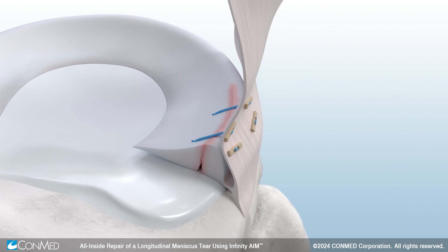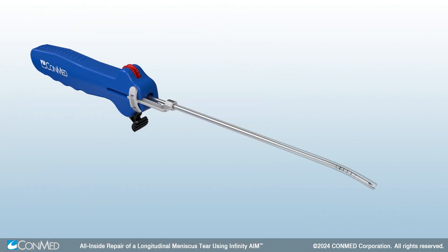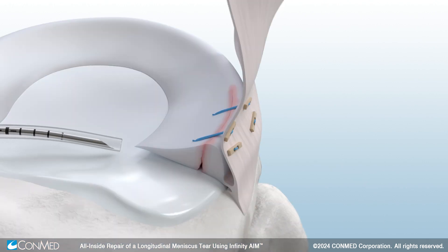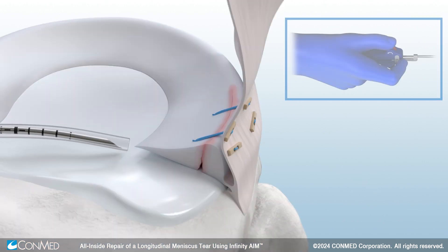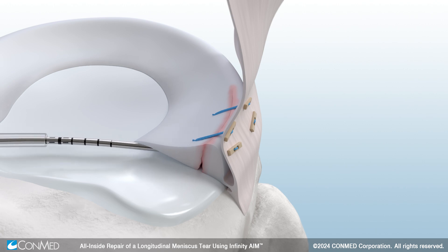The inferior part of the meniscus tear is now exposed. The Infinity Aim 15-degree reverse curve will now be used as it facilitates access to the inferior part of the meniscus. Position the device close to the tear and use your pointer finger or thumb to pull the white sleeve adjuster back to the desired depth, exposing the needle. With the Infinity Aim reverse curve, lift the meniscus up and slide underneath it.